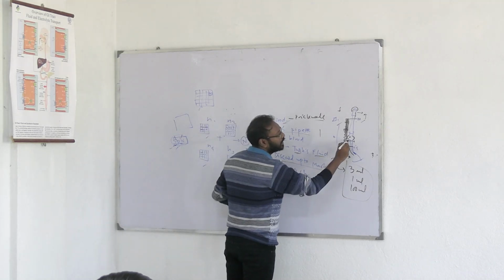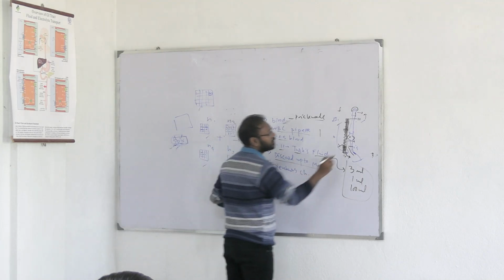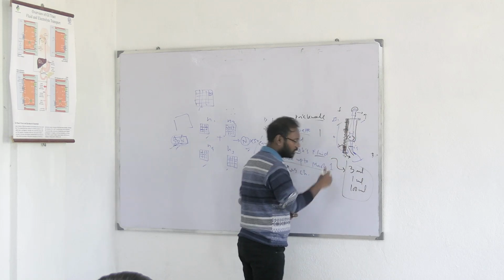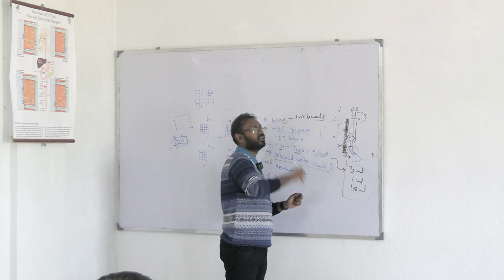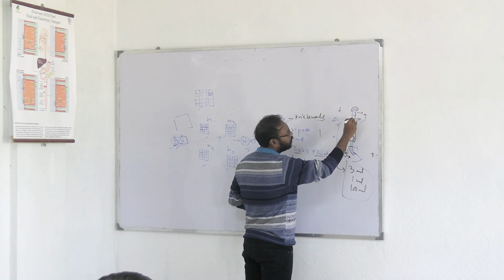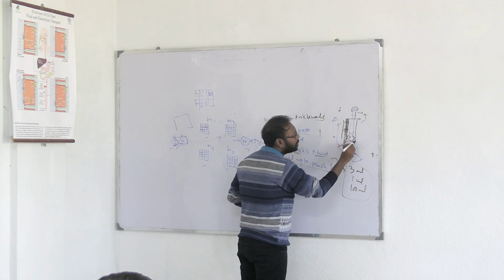What we do is discard 1 ml of fluid outside. So how will you do that? Simple, don't use your brain, just use your pipette. Mix the 11 like this, and after that, now that you have sucked the pipette, blow gently, so this fluid volume will slowly but surely go down up to 1.